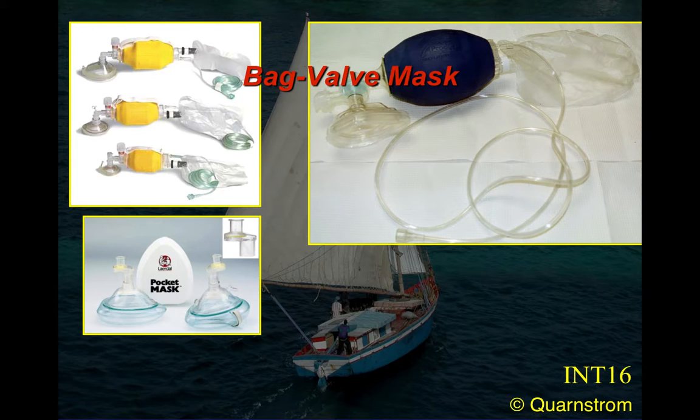And someday when you needed it, you grabbed it and you squeezed the bag here, and the rubber by then had disintegrated and the bag fell apart in your hand. These are made of plastic, and they're very inexpensive. As I remember, I paid less than $20. What's this bag for down here?